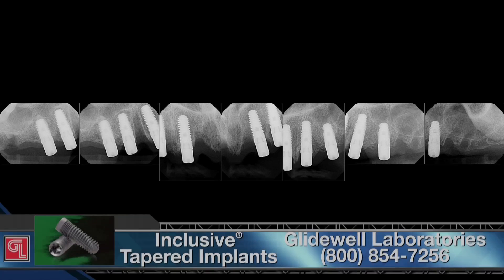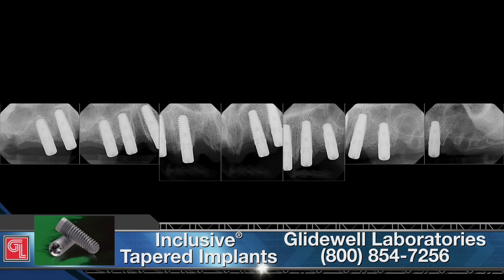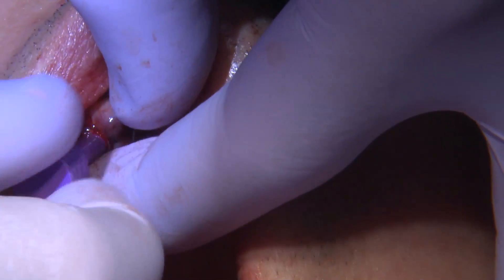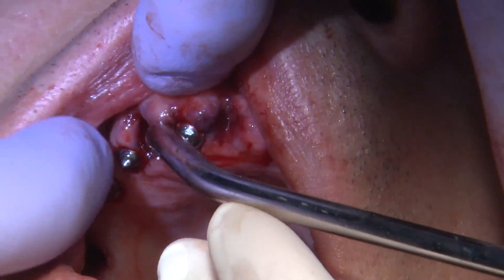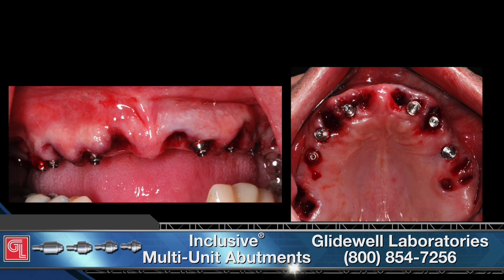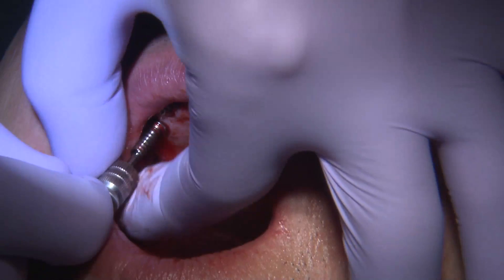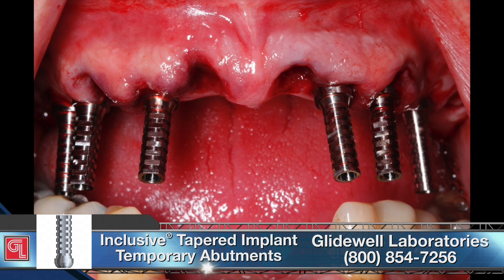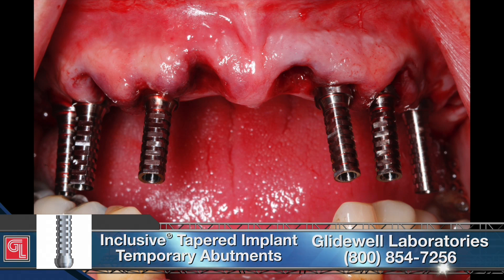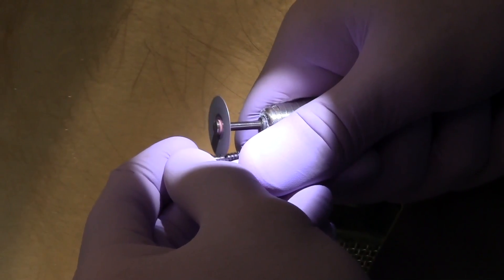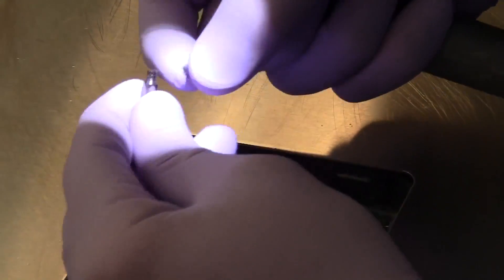Once that's completed, I retrofit the CAD-CAM-milled temporary on top of the implants. Here you can see the radiographs of all the implants in place. The next step is to change the implant platform — which is at bone level — to the tissue-level restorative platform by attaching multi-unit abutments. Then I place temporary cylinders on top of the multi-unit abutments. These look extremely long, so I need to fit the temporary over them and shorten them in the lab to the proper height so they don't protrude through the temporary.